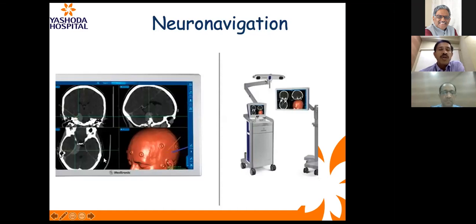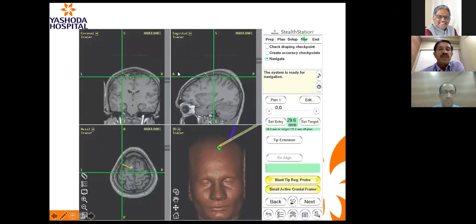and we are all used to navigate, all neurosurgeons are practicing this in a manner that the learning is short. When navigation came in, we were worried that if the students learn through navigation, what if they work in an area where navigation is not available? But one should understand that learning a 3D anatomy to a level where you can use without navigation is a long learning curve. It's very steep.